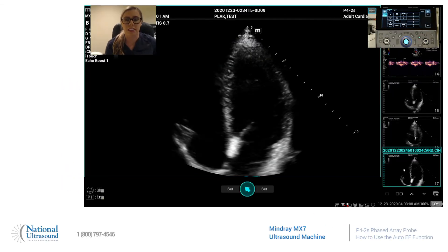Hello, I'm Kara David and I'm here today with National Ultrasound. I'm a registered cardiac sonographer and I've been doing this for four years. Today we'll be using the Mindray MX-7 and the P42S Probe, and what I will be showing you today is how to use the AutoEF.